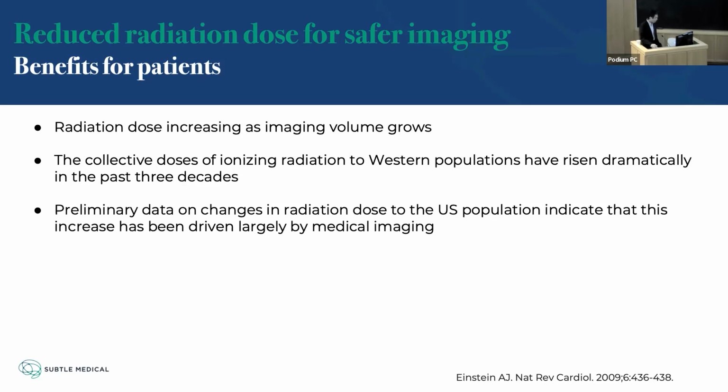On the other hand, we are also putting our efforts into reducing the ionizing radiation dose in radiology. Radiology practice has the responsibility to keep the radiation dose as low as reasonably possible. Recent technical advancements enable less radiation dose for a given scan. But the dramatic increase in the number and the complexity of the imaging procedures across all of radiology has resulted in an ever-growing overall radiation dose. And to slow the trend of this increasing overall radiation dose, we still need to continue to push the state of the art in ultra-low dose imaging.